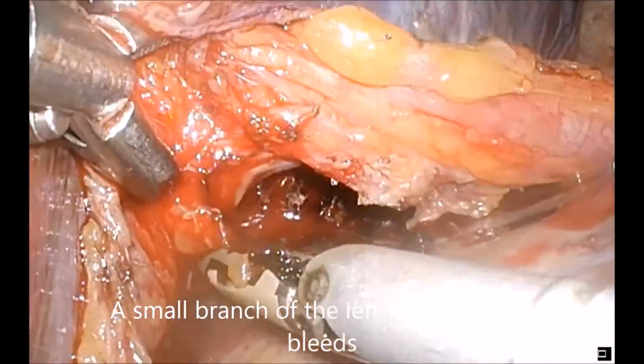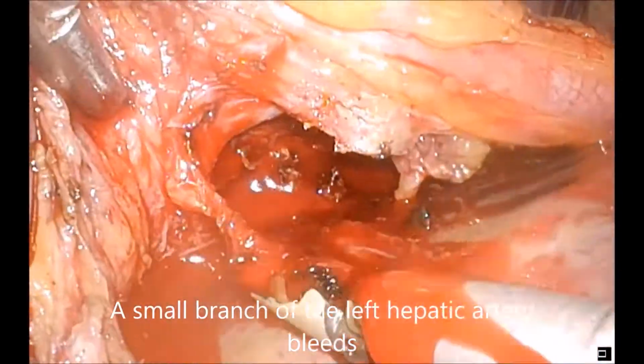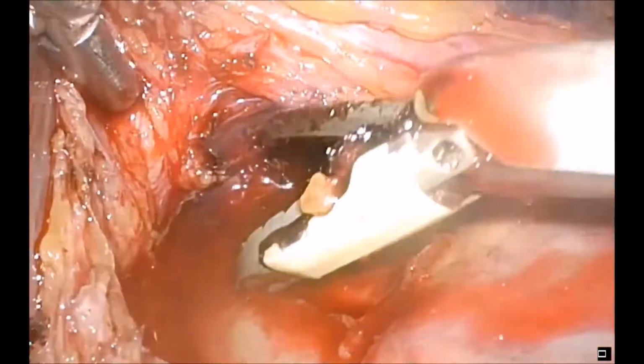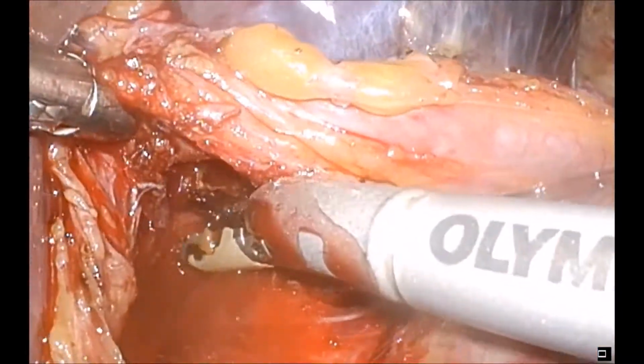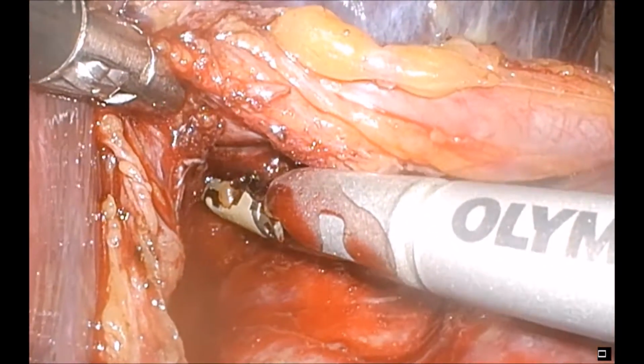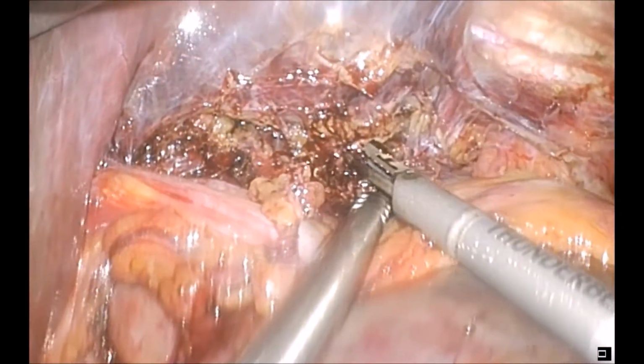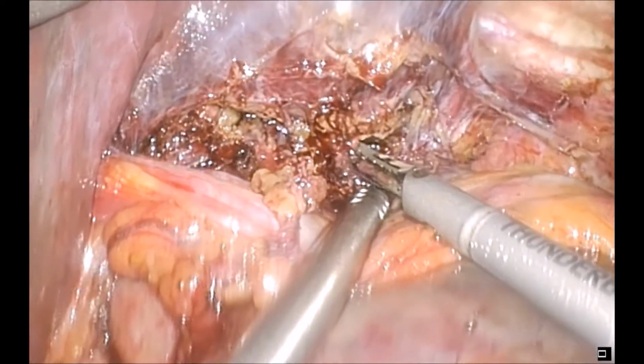A small bleeder from the back of the hepatic artery is identified, and has obviously been pulled on while we're trying to preserve the main left hepatic artery, which we were successful in doing.